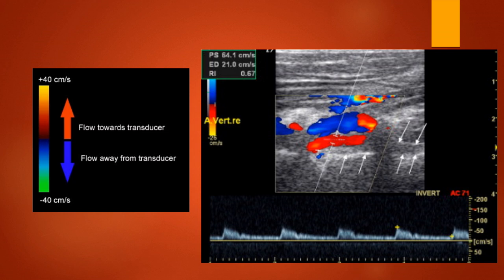So you're going to see some techs kind of take the lazy way out. They're going to drop it down below 60 so that they can make their lives easier. And it's technically fine, but it's not great. You want to keep it at 60 and then just change your scanning approach.